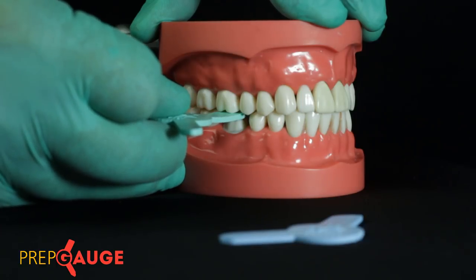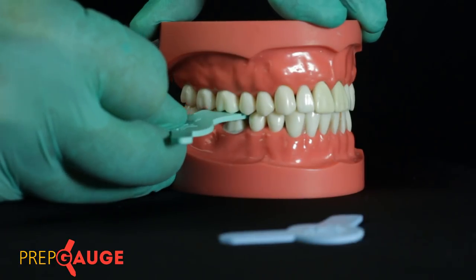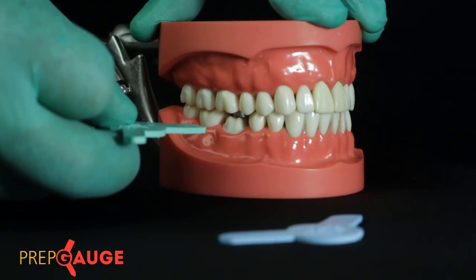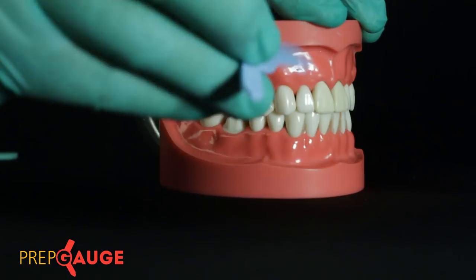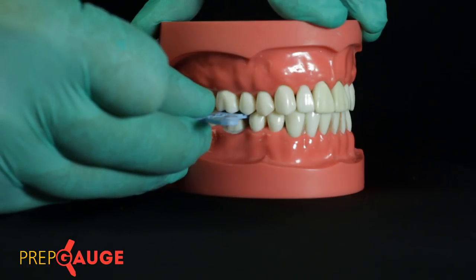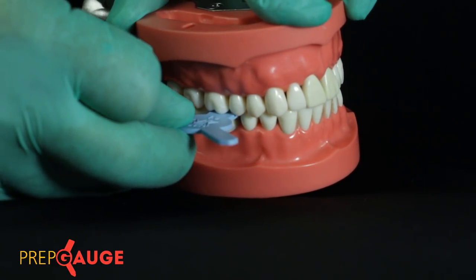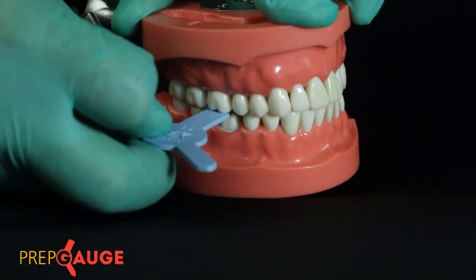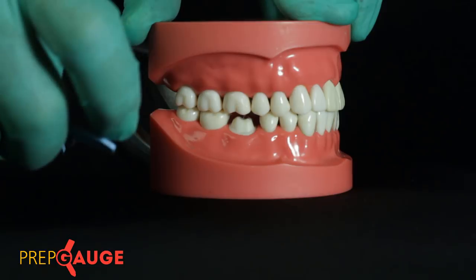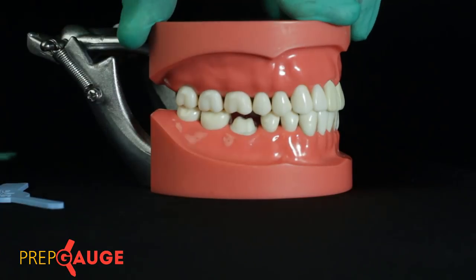Now if I try to push the gauge further, it folds up but does not go further — because the lingual aspect has not been reduced by 2 millimeters. To quantify that, I use the blue gauge which is 1.5 millimeters. As I push through, it slides right in and I can easily tuck it out — it does not give too much resistance nor does it slide out freely. This confirms we have exactly 2 millimeters of buccal reduction and 1.5 millimeters of lingual reduction.